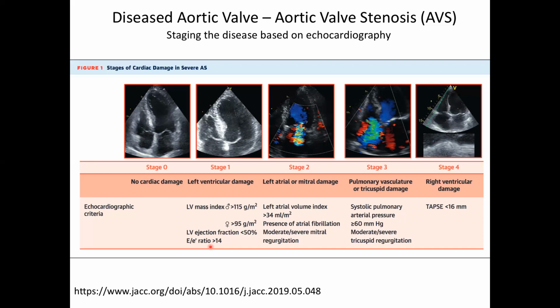And it turns out, if the mechanics of the valve ring moving up gets reduced, i.e. it slows down, and the velocity pumping into the LV, this is filling, is high because there's a high pressure in the left atrium, that's indicative of a sick person, right? So when this ratio gets high, you're in bad shape, or you're getting into worse shape, right?